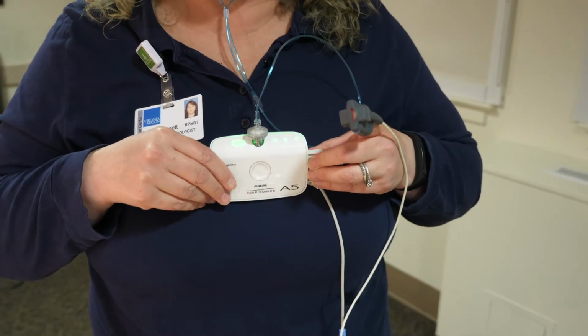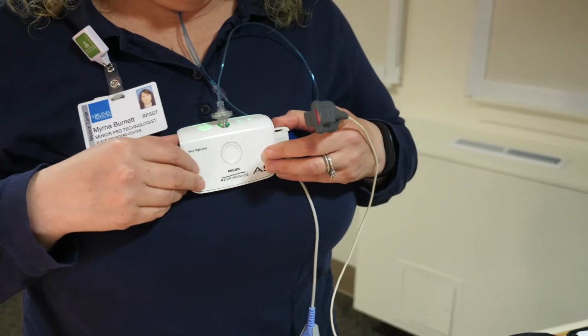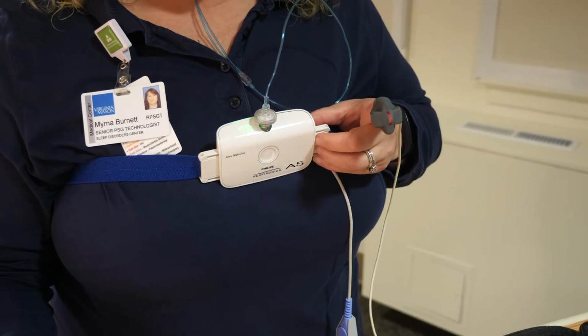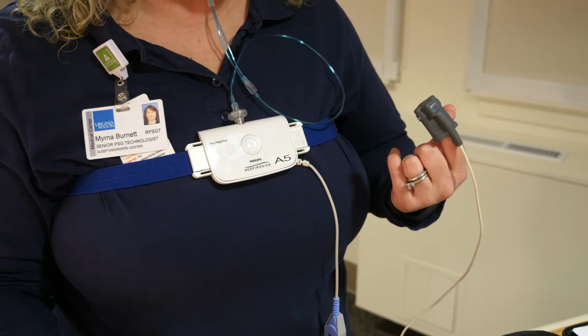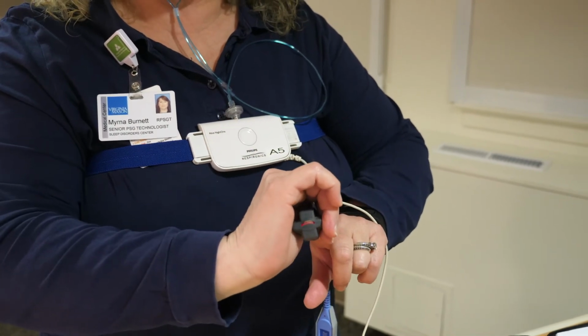So this is really important. The lights will be on green for about 30 seconds to a minute, and then one by one, all of the lights will turn off. So the unit while you're sleeping tonight will be dark. You'll know, even though the unit is dark, that the unit is still on and recording, because if you look in the end of your finger, you'll have a red light.